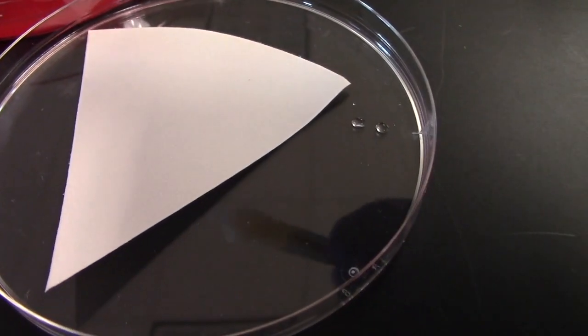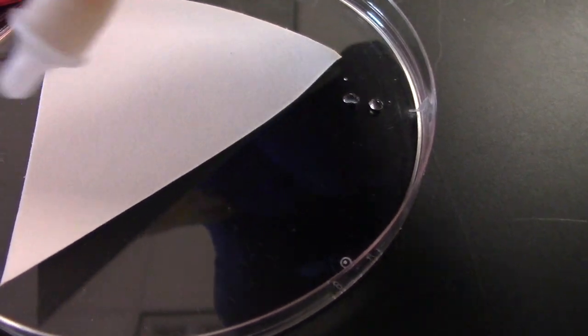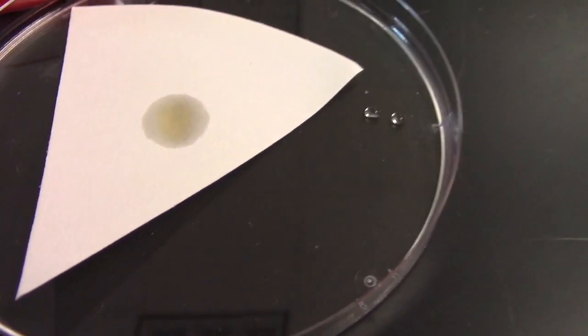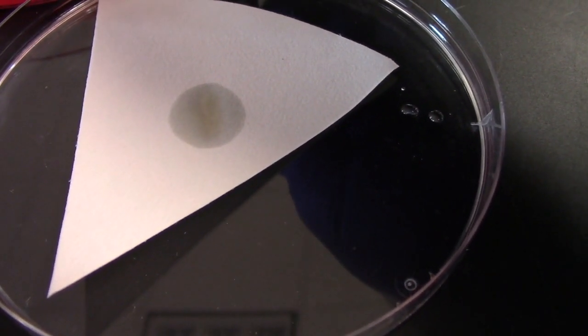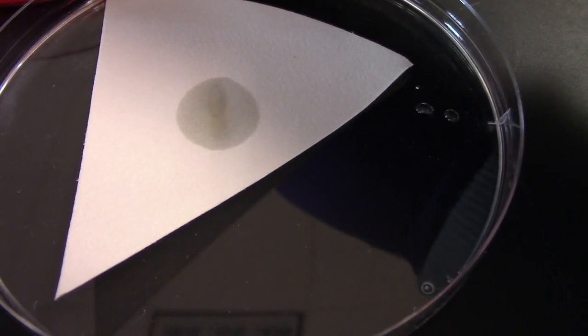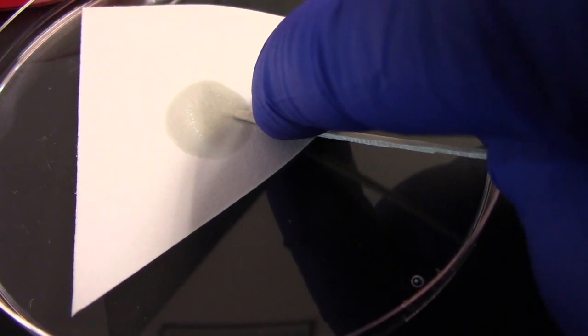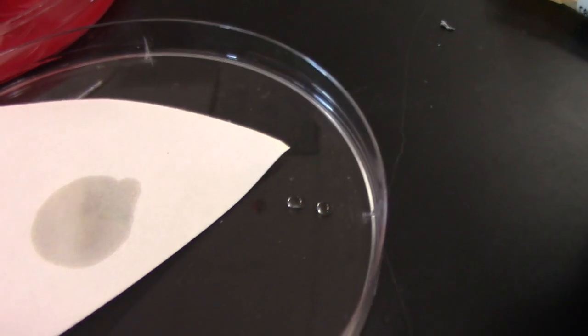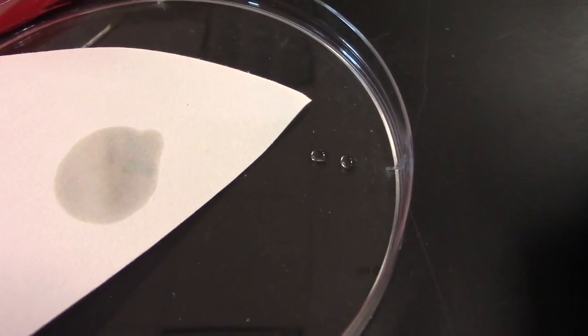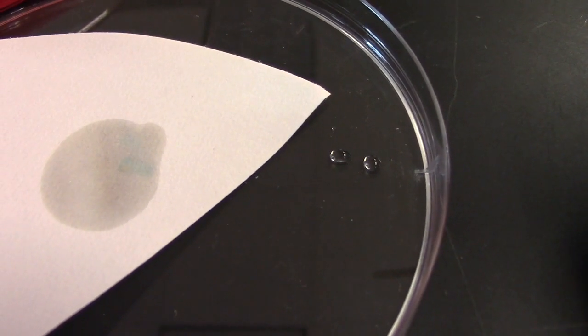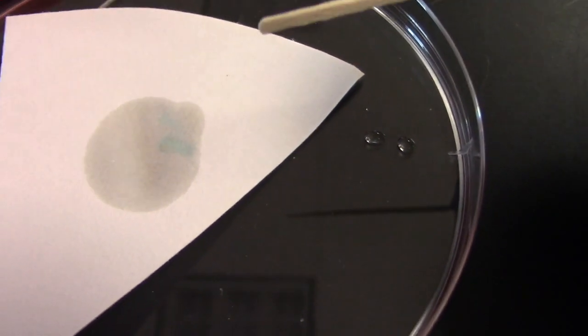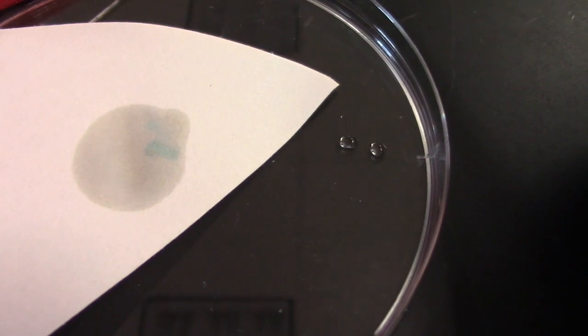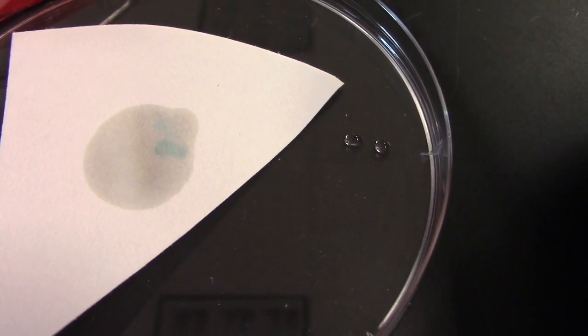Another spot test that we're going to do is the spot indole test. Again, we'll use a piece of filter paper inside the lid of our petri dish and drop on one drop of the indole reagent. We'll obtain a small amount of colony and smear it onto the area. Our positive indole test will show a color change to a blue-green color. You can see that color developing here.